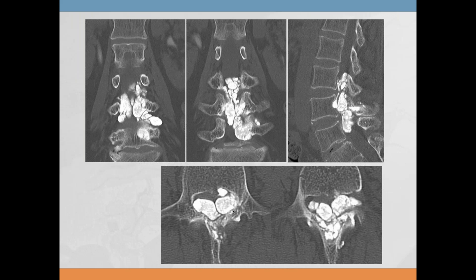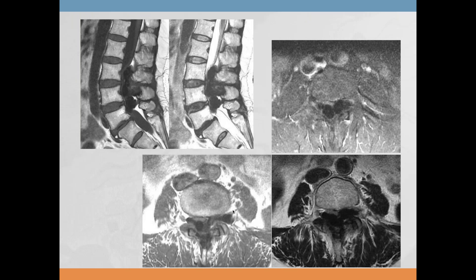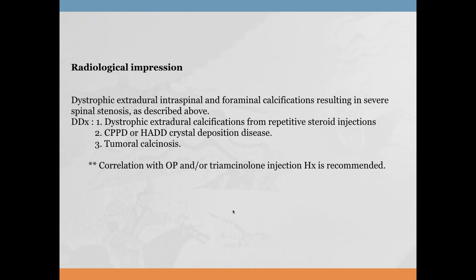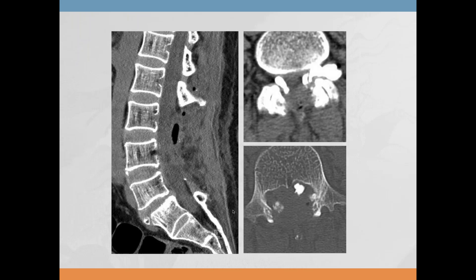There's a CT showing densely calcified structures in the spinal canal overlying the pedicles of L3, L4, and L5. At this point it becomes clear the patient has had multiple steroid injections. The differential considered included dystrophic extradural intraspinal foraminal calcifications in severe spinal stenosis, CPPD, and tumoral calcinosis. They went to surgery and these are the post-op findings.